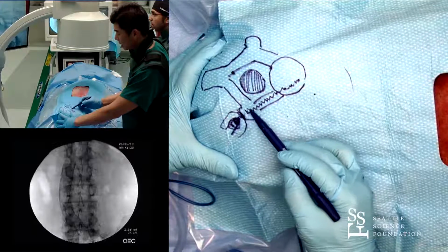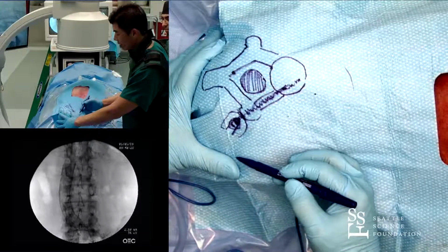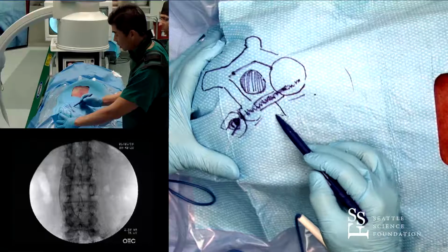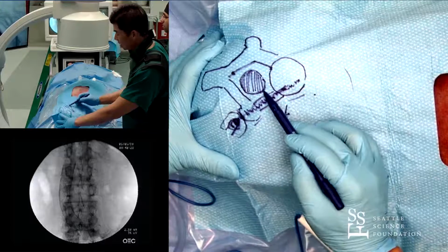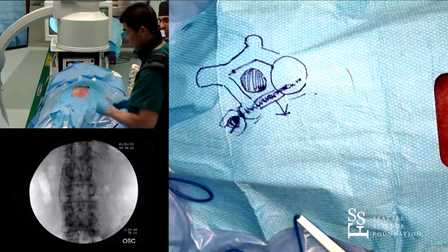So placing this screw through this narrow piece of bone can be somewhat challenging, I would say, because you don't wanna miss. If you miss laterally, it's okay. But if you miss medially, you could injure the nerve root or the spinal cord itself, and that's never good.